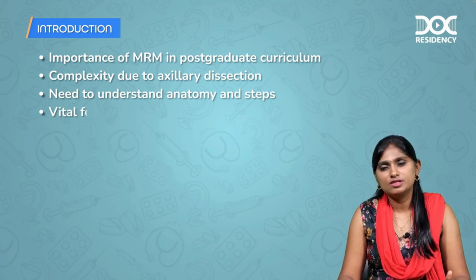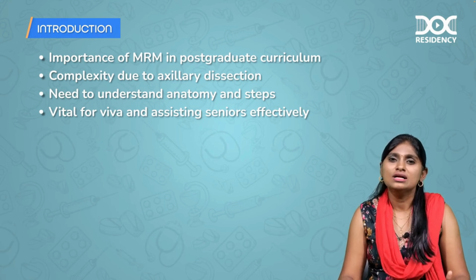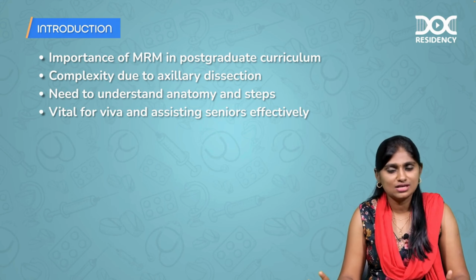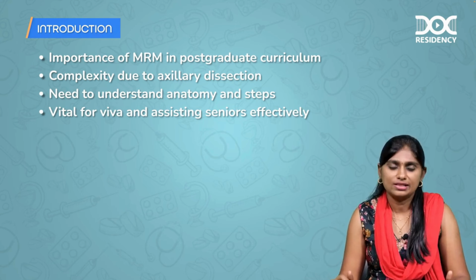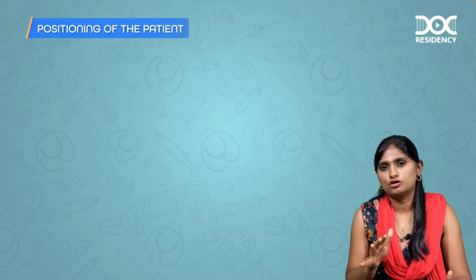The steps of the surgery will be asked as a very important viva question during your clinical examination also. And if you know the steps properly, you will be a very good assisting surgeon to your seniors doing it, so that you can learn the surgery well. Okay, so we'll go ahead with the surgery. First, I'll be talking about the positioning of the patient.